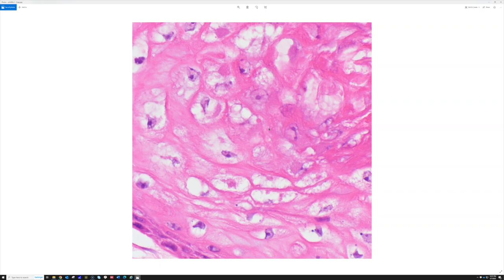In that second case, there is a more convincing example of the pink viral inclusion in a keratinocyte — those little pink dots are the classic finding for ORF, but you have to hunt for them. I would rely more on the other features and put it together with clinical exposure history. In my community near a rural farming area, the incidence of ORF increases after the county fair when many people handle sheep.